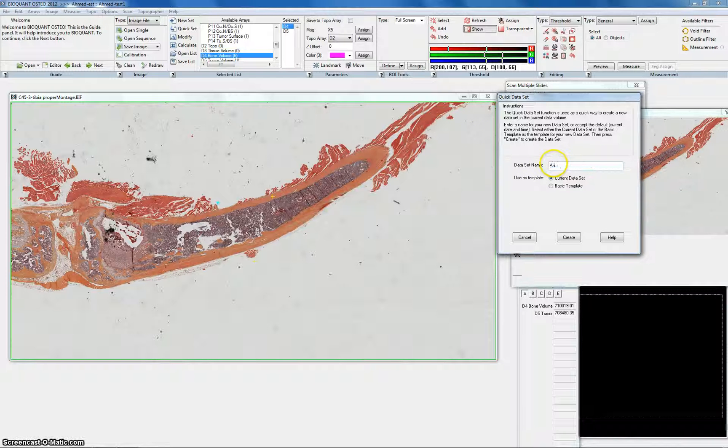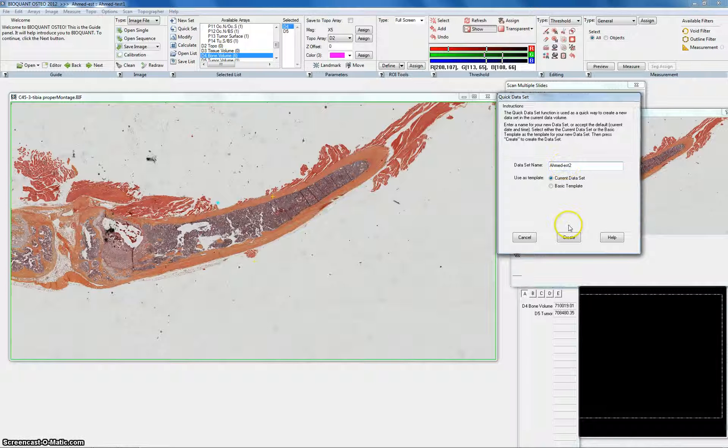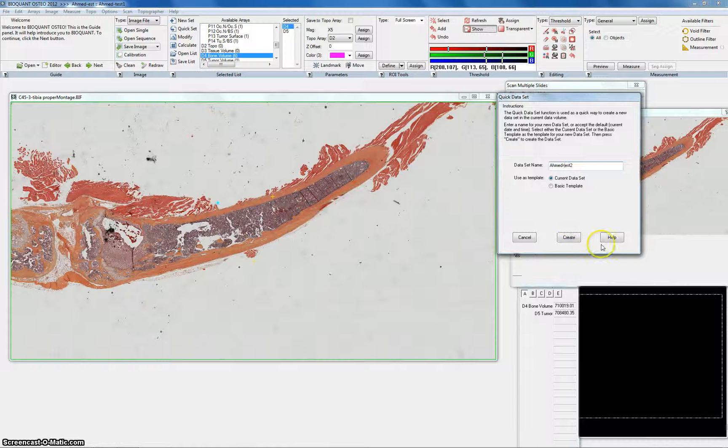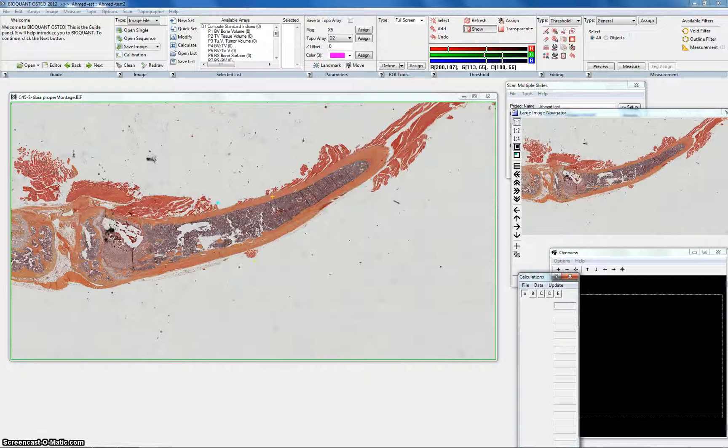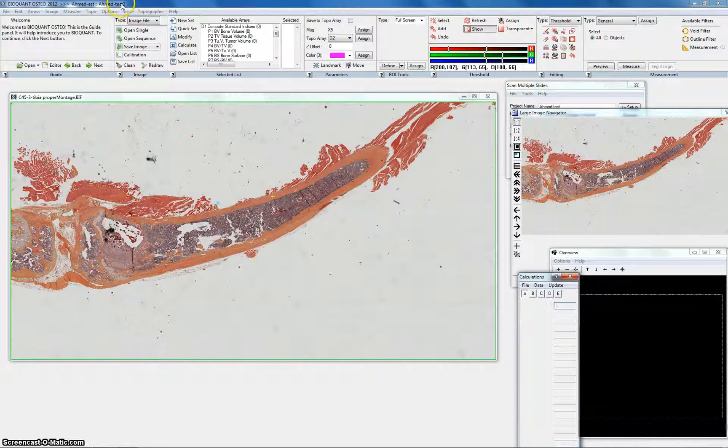This one is Ahmed Test 2. I forgot that again. And then you create it. Now it's going to be Ahmed Test and then this is the second project, Ahmed Test 2.